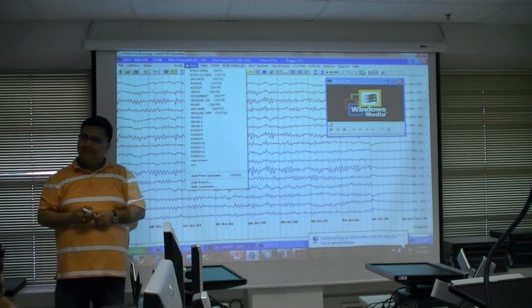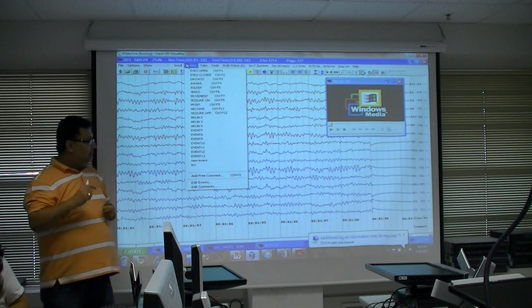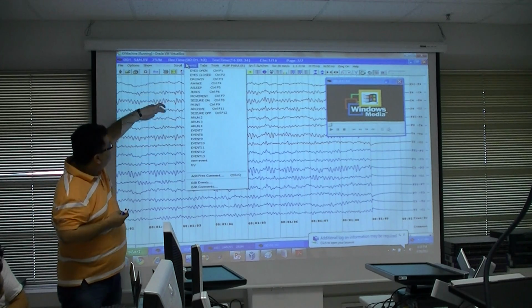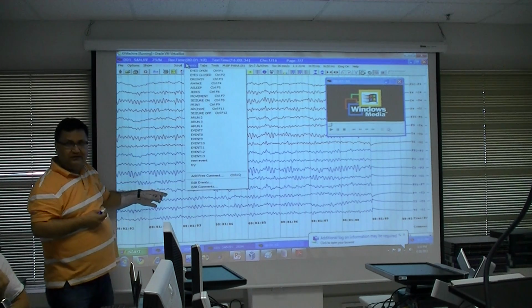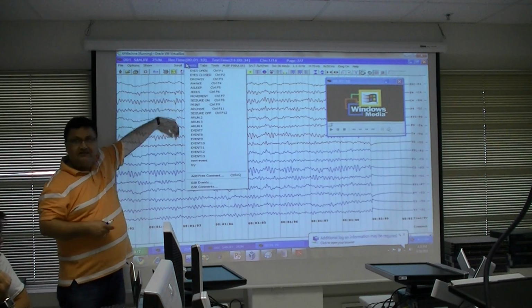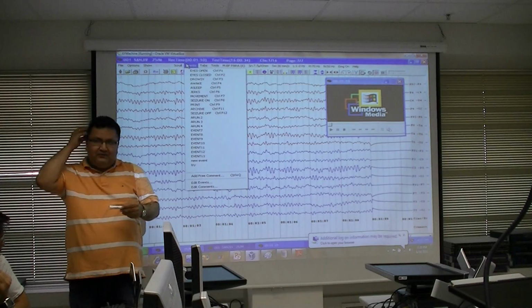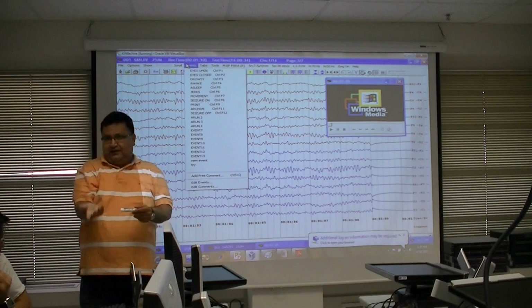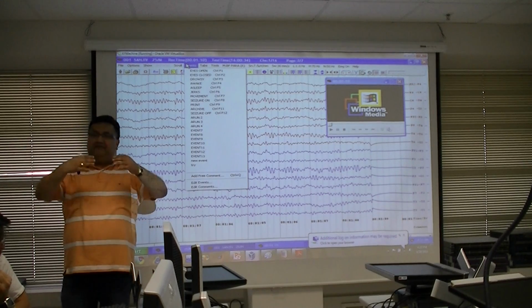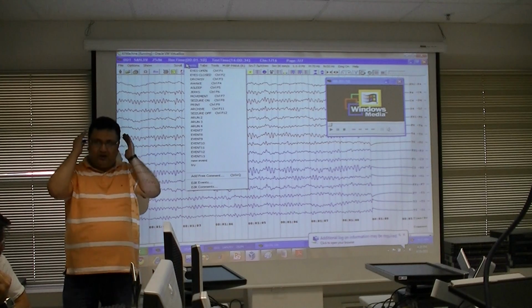The reason is that by eye flickering, he may have an effect on this channel. There is no effect on this one. In another function, he may have this change and this is not changed. Different channels means you are taking signal from different parts of the brain. So I have to check that if I do some action, where it has the impact. It has the impact only in this part, or it has impact on all these parts.